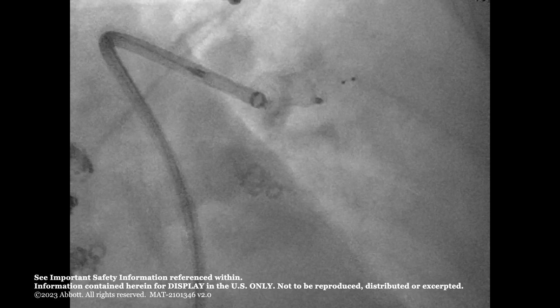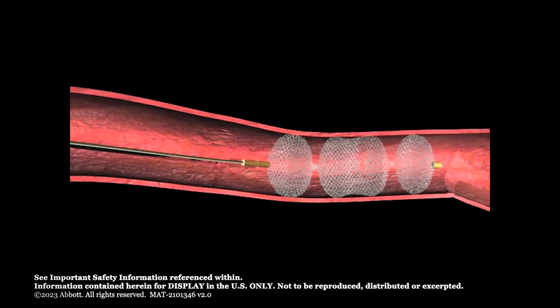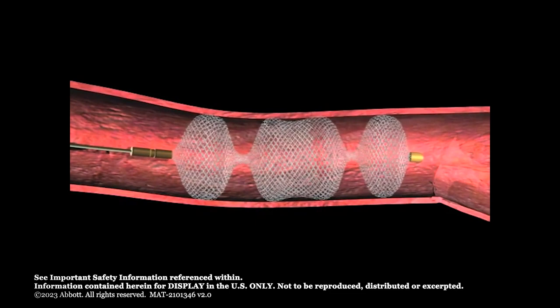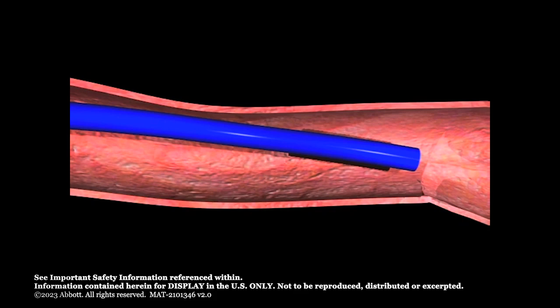Carefully examine the Amplatzer Vascular Plug 2 position with fluoroscopy. Perform contrast media imaging to evaluate position and occlusion at the site. If the position is not satisfactory, recapture the plug by pulling back slightly on the delivery wire and advancing the delivery system back over the plug until the entire device is within the delivery system. Reposition and redeploy.